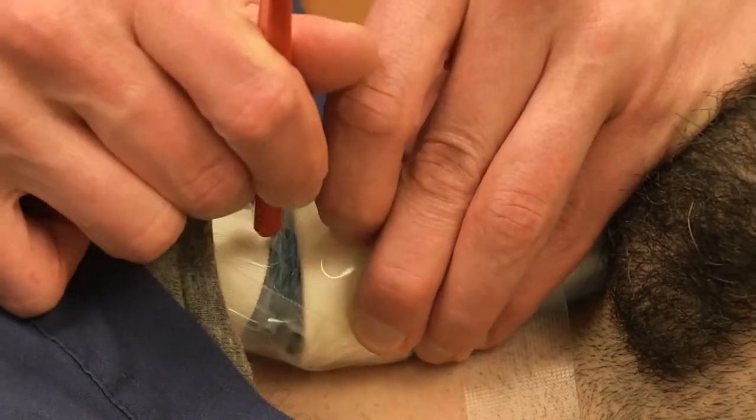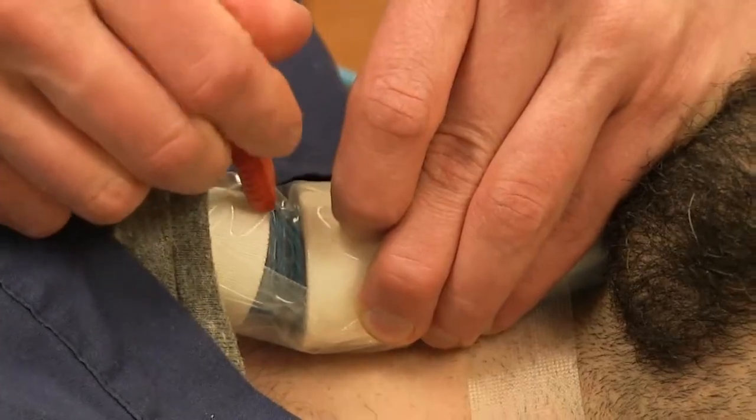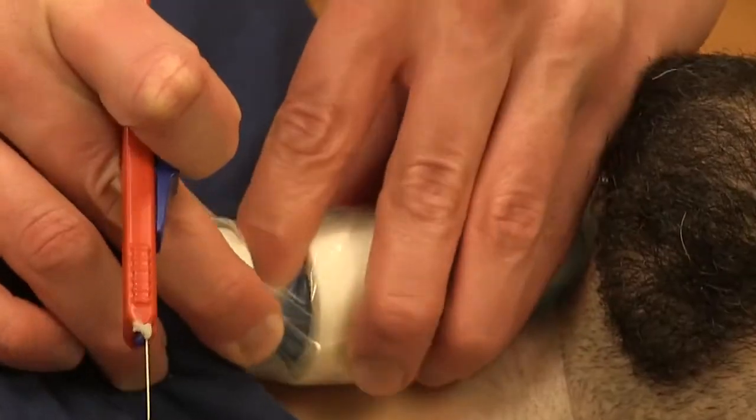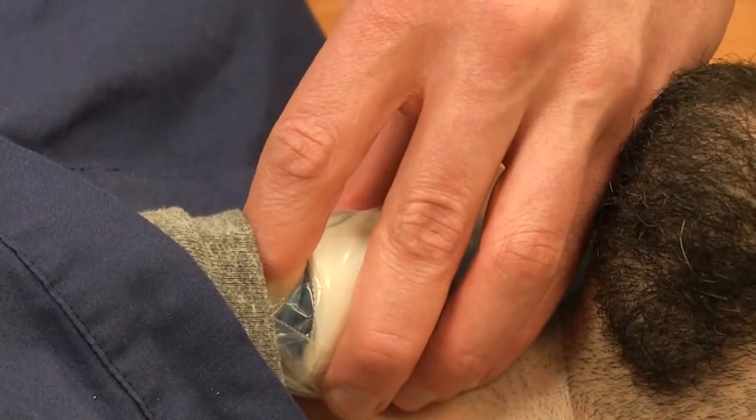I'm now going to re-feel the membrane through skin, get my scalpel in there, and go towards me all the way, then flip and go away from me all the way.